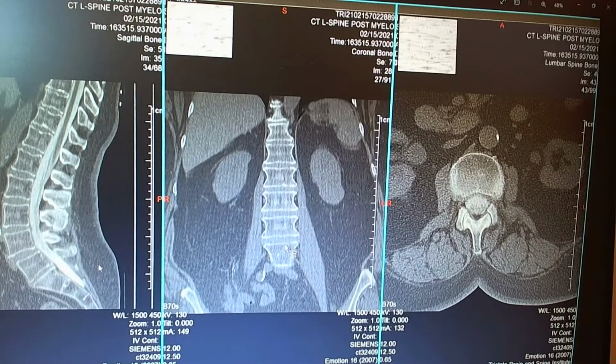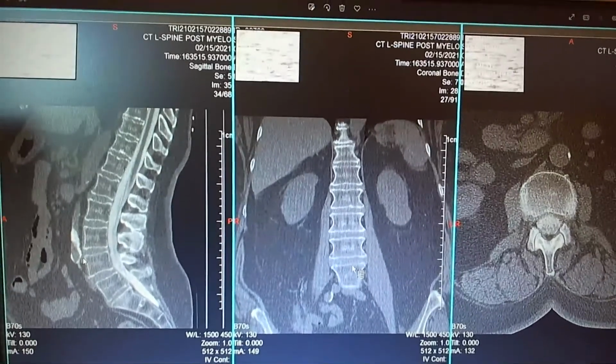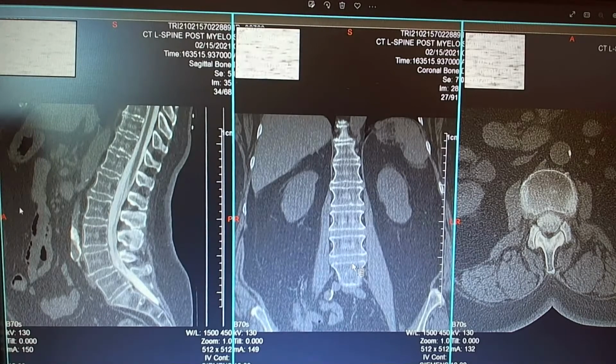Is it bone? A little to the left? Like this? Oh, yeah, I see. You guys weren't able to see all of that. Okay. What is this material here and here? What do we have under the skin? Under the skin, yeah, adipose tissue.